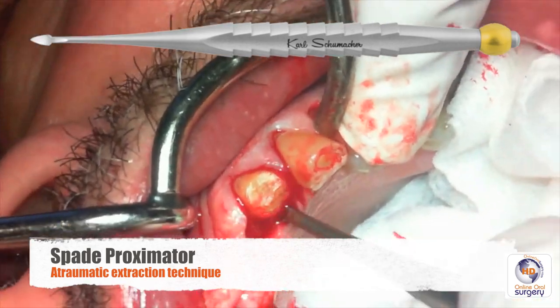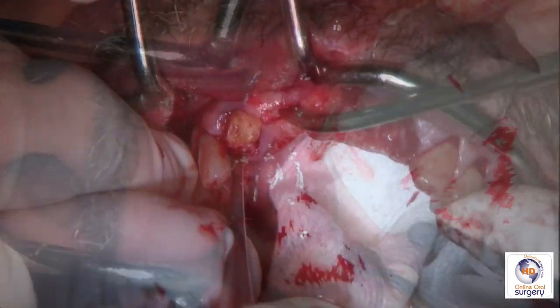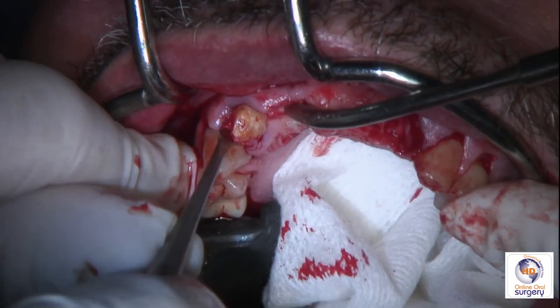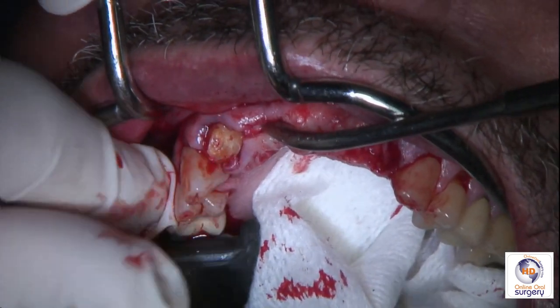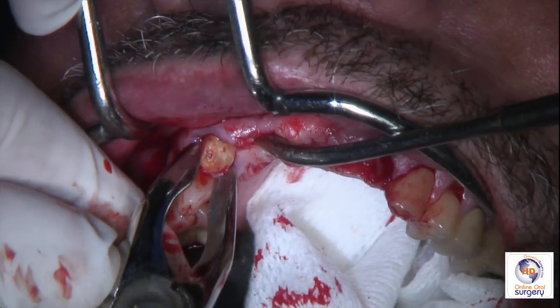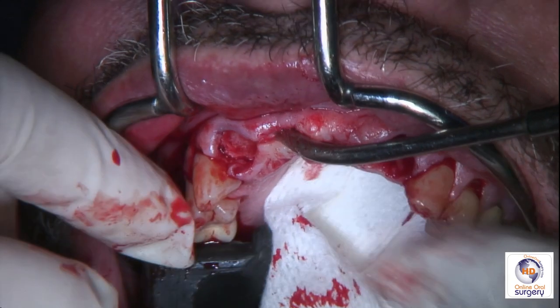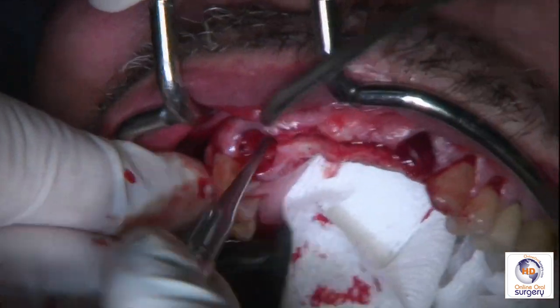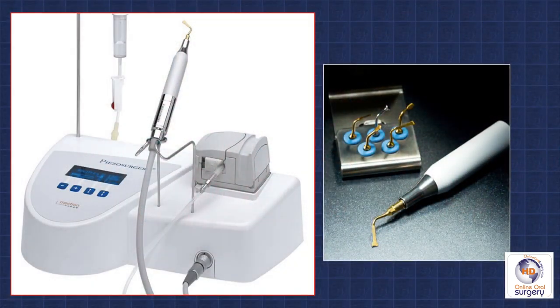Then using a spade proximator, we're going to perform atraumatic extraction of tooth number 11 and tooth number 7. You can see here how the proximator is luxating the tooth and expanding the alveolus, so then we could easily take it with a forceps and remove it. We're again then going to curette out the socket, remove any granulation tissue or any periapical lesions, and then irrigate thoroughly.